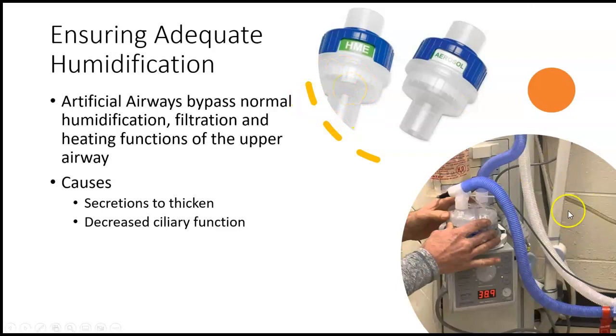So there's a little bit less risk of that when you're using these heated systems, but these heated systems also, by the nature of relative humidity, can have a lot of condensation in them, a lot of rain out, which then can cause unintentional aspiration of ventilator tubing fluid in the patients as well.